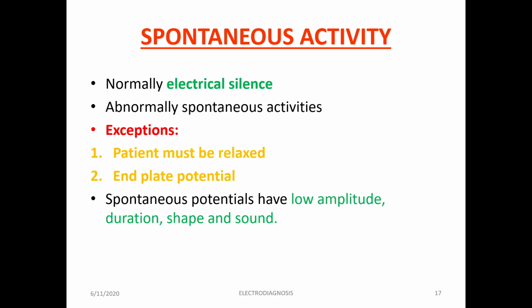Why? Because in the first case, it is possible that the patient is not relaxed. As this needle is an invasive procedure, the patient may be under stress or anxiety. So it is possible there will be contraction of the muscle just because of excitement, anxiety, stress. In that case, activity will be visible on the screen. So actually it is not spontaneous, it is because of muscle contraction. Even though it is at a subconscious level, it cannot be considered as involuntary contraction. Clear? So the patient is not relaxed. In that case, you just assure your patient to be relaxed.